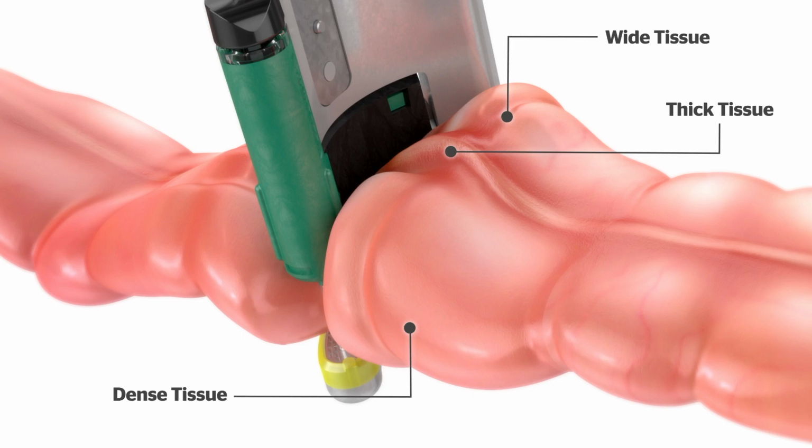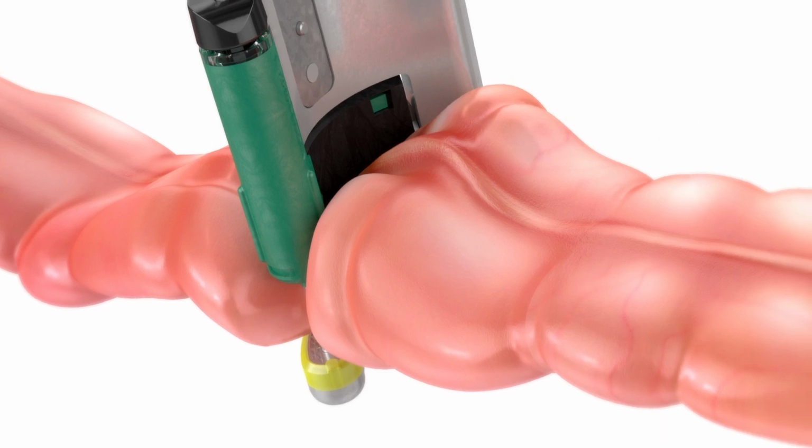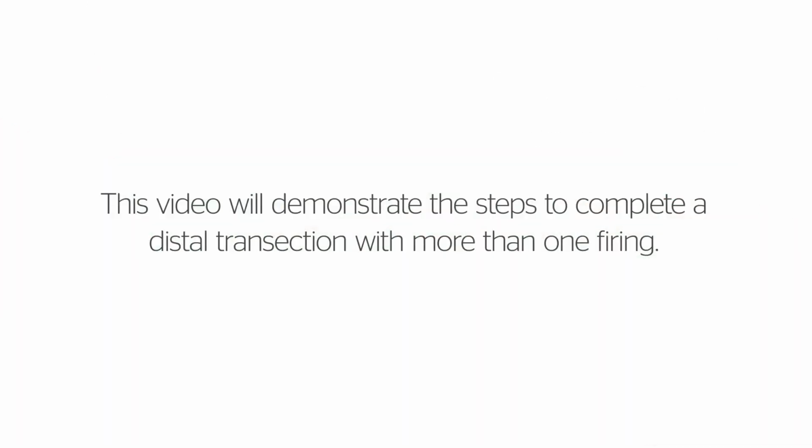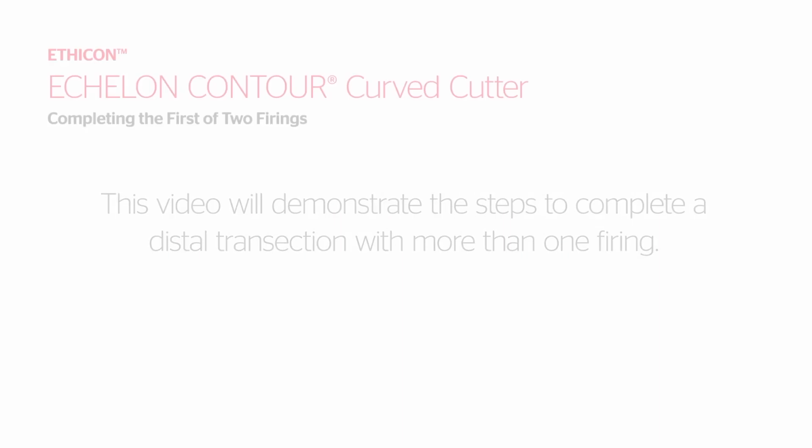Attempting to force the trigger to complete the closing stroke with too much tissue or thickened tissue may result in poor staple line integrity, with possible leakage or disruption. In addition, instrument damage or failure may result. This video will demonstrate the steps to complete a distal transection with more than one firing.